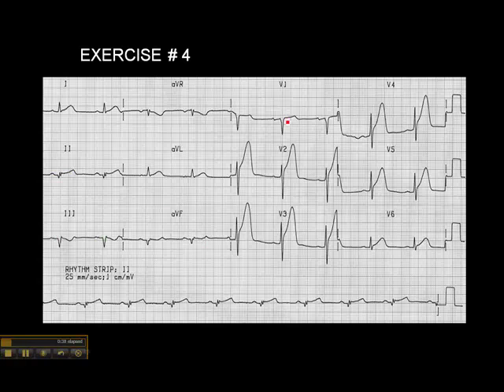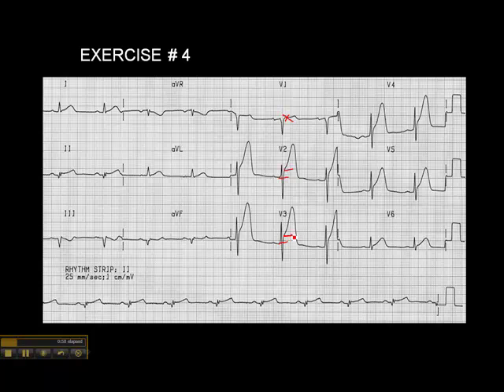Now if we look at the anteroseptal leads, V1 through V4 — do we have ST elevation in V1? That would be no, or it would certainly be a squinter. In V2, yes, we have baseline here and we have the J point there. V3, we have the baseline here and we have ST elevation, J point there. V4, yes, we have baseline here, J point here, so we have ST elevation.